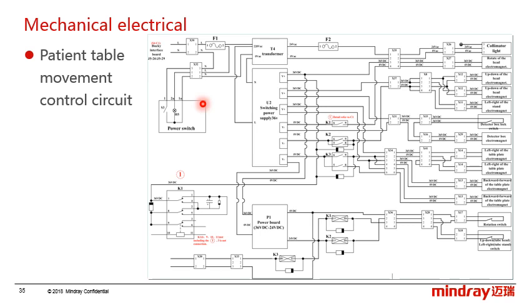We should know how to read the circuits. For example, the collimator light.